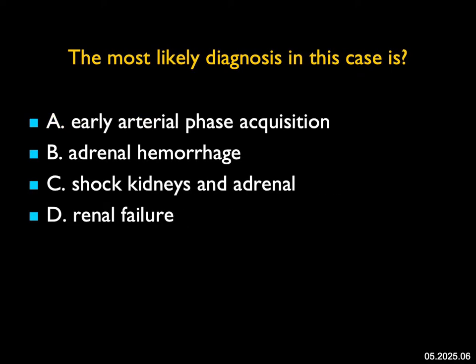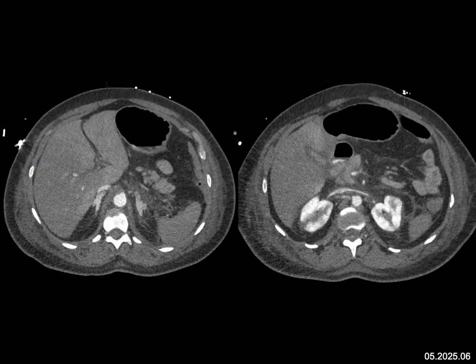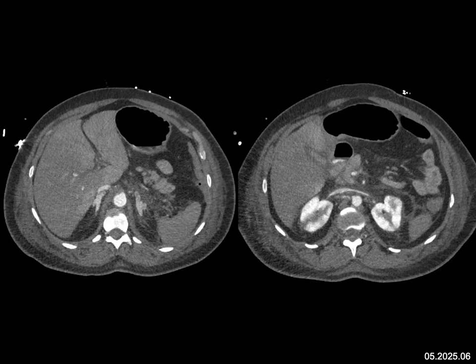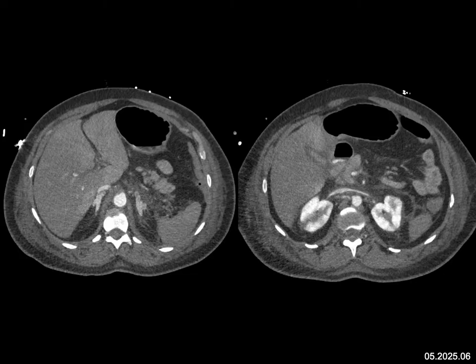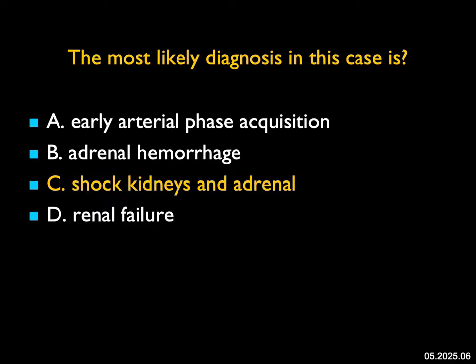The most likely diagnosis in this case: very bright adrenal glands. If you show me very bright adrenal glands, the first thing I think about is shock — it's one of the findings in hypoperfusion syndrome. I then look and see the IVC is very flat. I also see patchy enhancement of the kidneys with a lack of definition of the corticomedullary interface, again a finding commonly associated with hypoperfusion syndrome. This is not just early injection, not adrenal hemorrhage. When you see the adrenals and the kidneys in this configuration, it's hypotension. The most likely diagnosis is shock, and this may be one of the earliest signs of hypoperfusion syndrome.